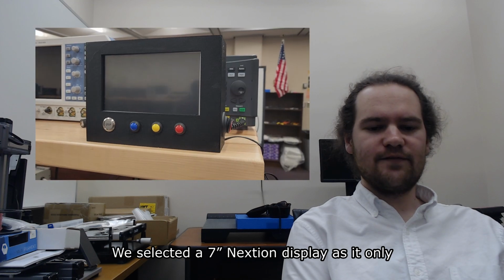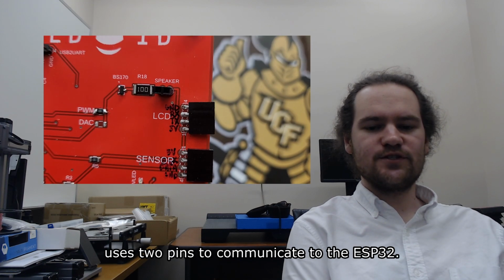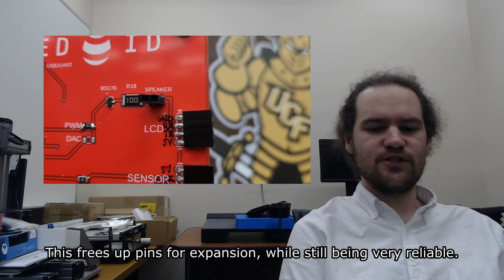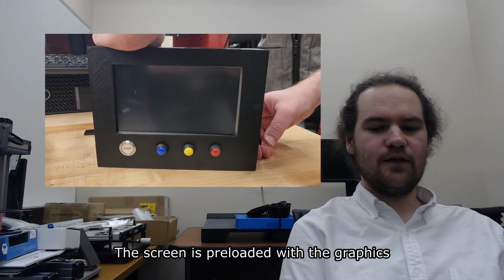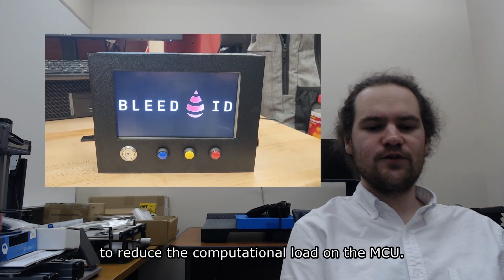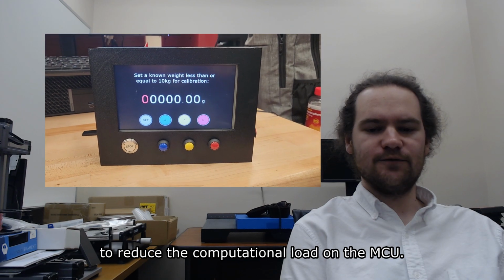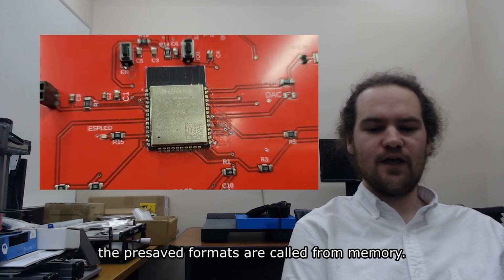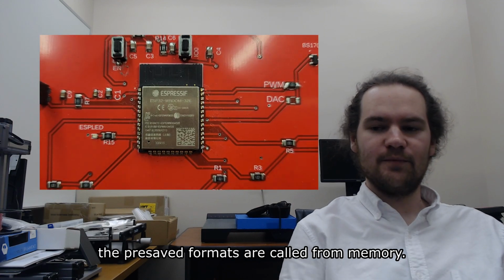We selected a 7-inch Nextion display as it only uses 2 pins to communicate to the ESP32. This frees up pins for expansion while still being very reliable. The screen is preloaded with graphics to reduce the computational load on the MCU. The ESP32 does not need to repeatedly draw the screen. The pre-saved formats are called from memory.